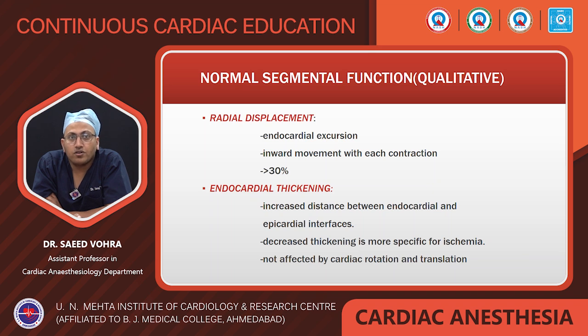Another qualitative parameter is endocardial thickening. In endocardial thickening, there will be increased distance between the endocardial and the epicardial interfaces. The decreased thickening is more specific for ischemia, and it is not affected by the cardiac rotation and translation motion.